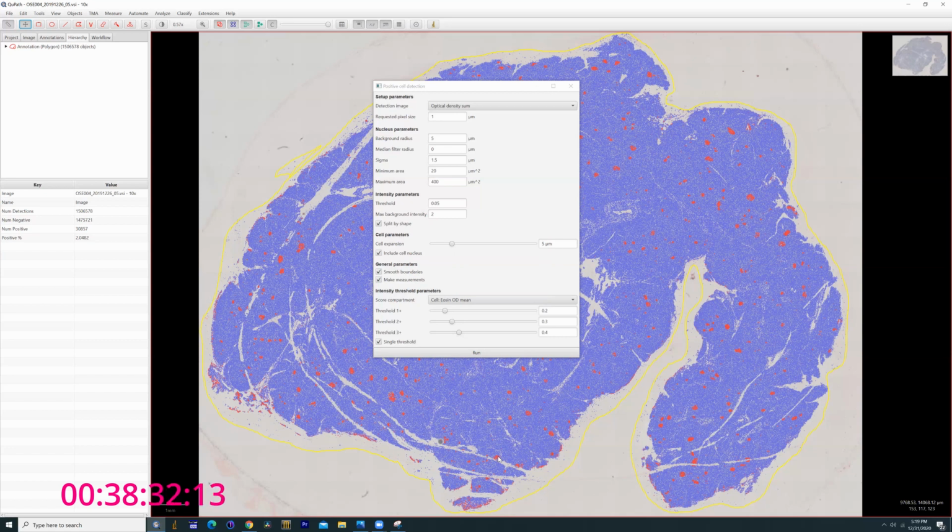You do a little bit of video editing, but honestly, the GPU is not so utilized. What is utilized is RAM. This unit has 64 gigs of RAM, and the software actually defaults to 32 by default. So if you have a smaller machine, it will run, but it's going to take a lot longer to render.